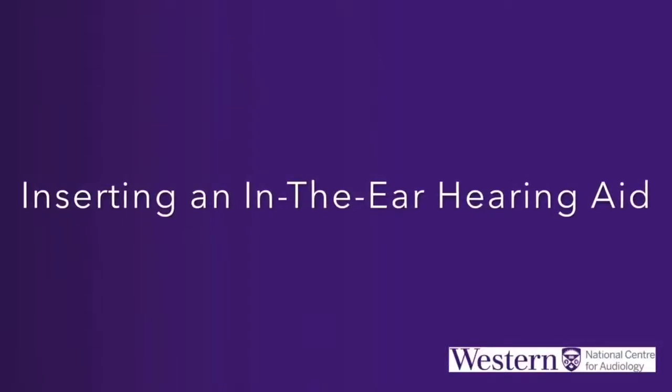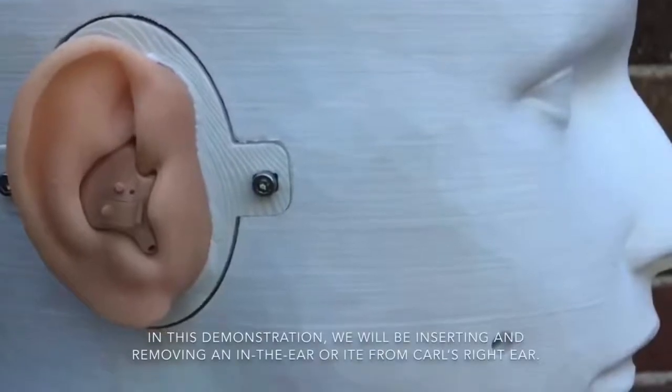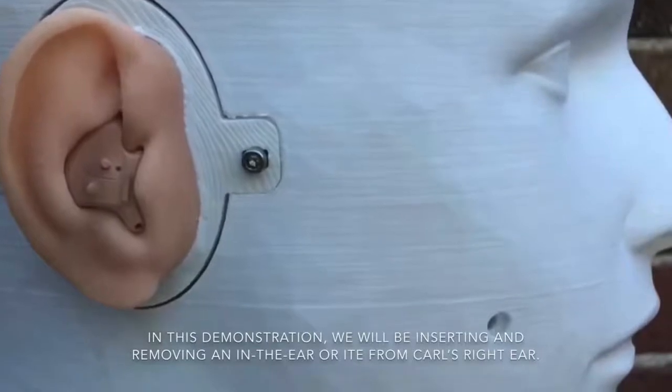Inserting an in-the-ear hearing aid. In this demonstration, we will be inserting and removing an in-the-ear, or ITE, hearing aid from Carl's right ear.